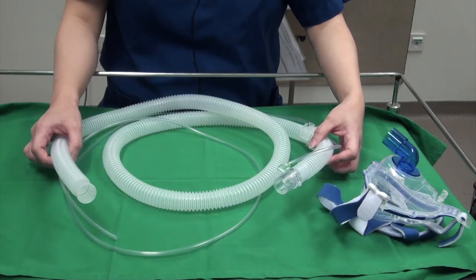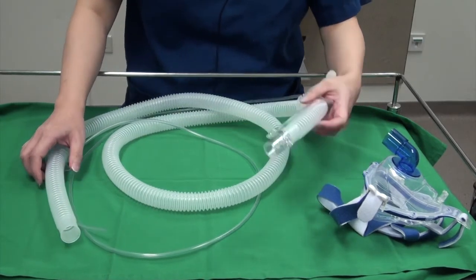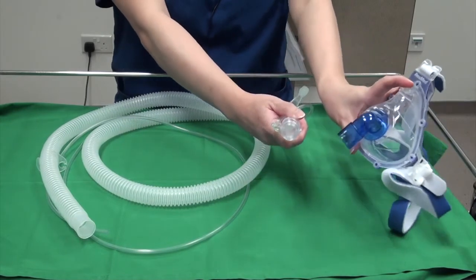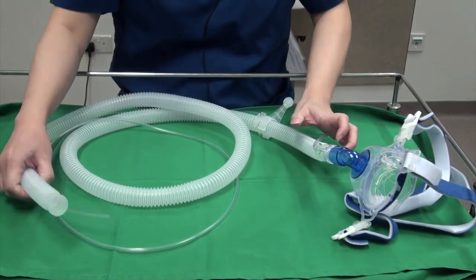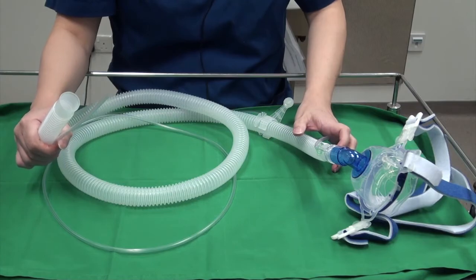Please ensure that you connect the 2 different ends to the correct parts. This here is the patient's end. You can connect this directly to the NIV mask, like this. This here is the machine end. You can connect it directly to the machine.